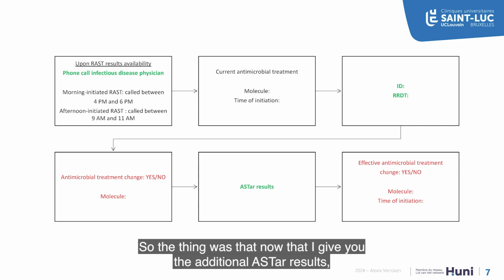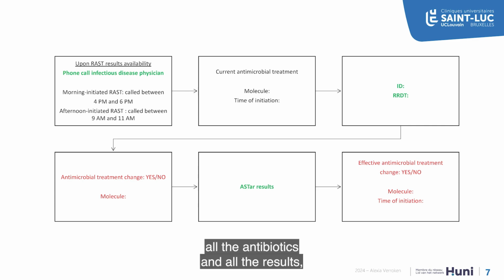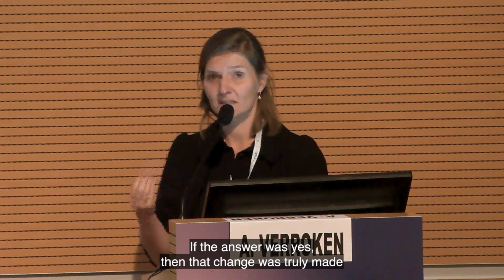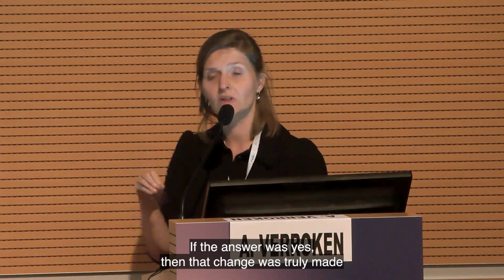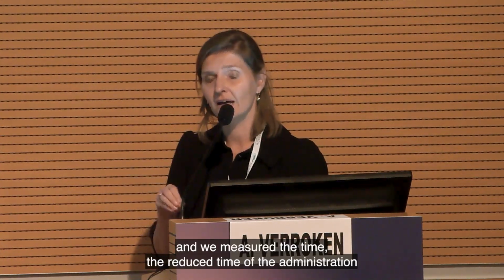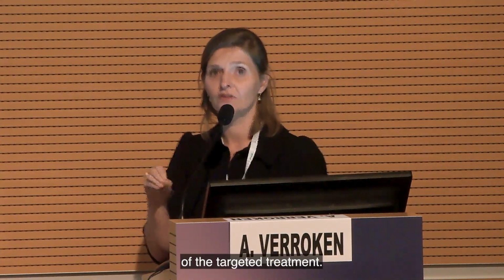So the thing was, okay, now that I give you the additional ASTar results, like all the antibiotics and all the results, is this also going to change something to the therapy that you chose for your patient? And if the answer was yes, then that change was truly made, and we measured the reduced time of the administration of the targeted treatment.